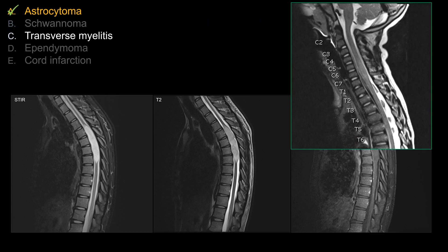Choice C is transverse myelitis. While transverse myelitis can show some cord expansion due to acute inflammation and edema, you should never see this expansile look exactly like a big mass lesion. Transverse myelitis tends to be longer than three vertebral body segments — that's a nice distinguishing feature versus MS, for example. This looks very much like a tumor; it does not look like a mildly expansile transverse myelitis at all.